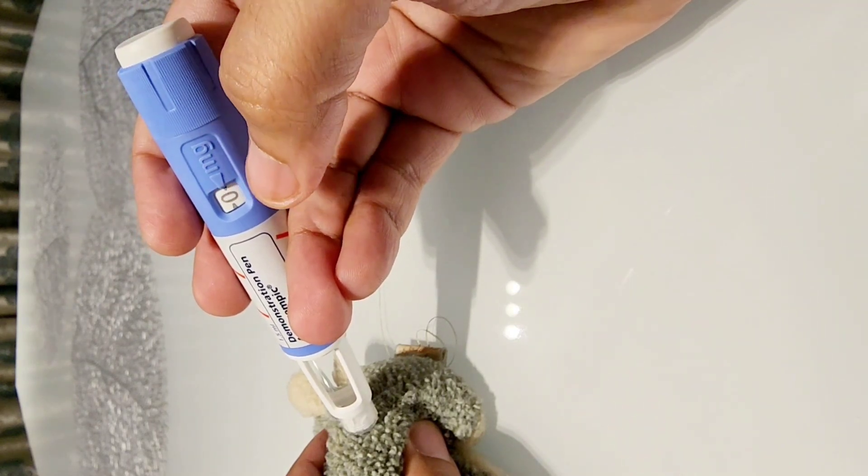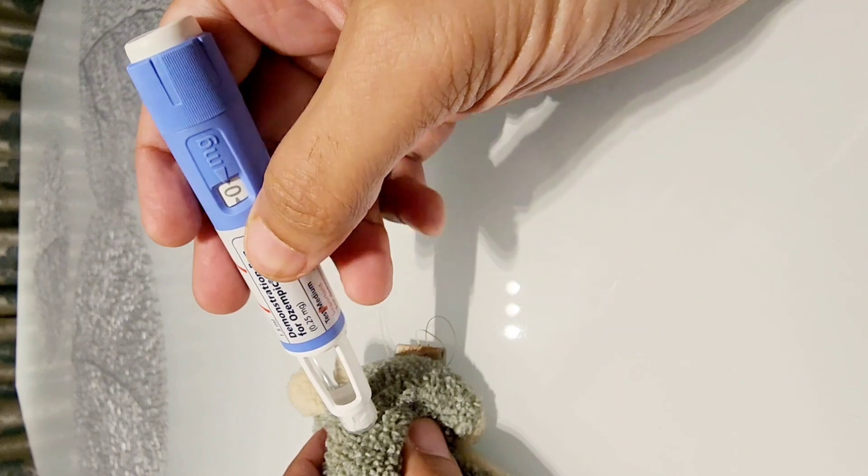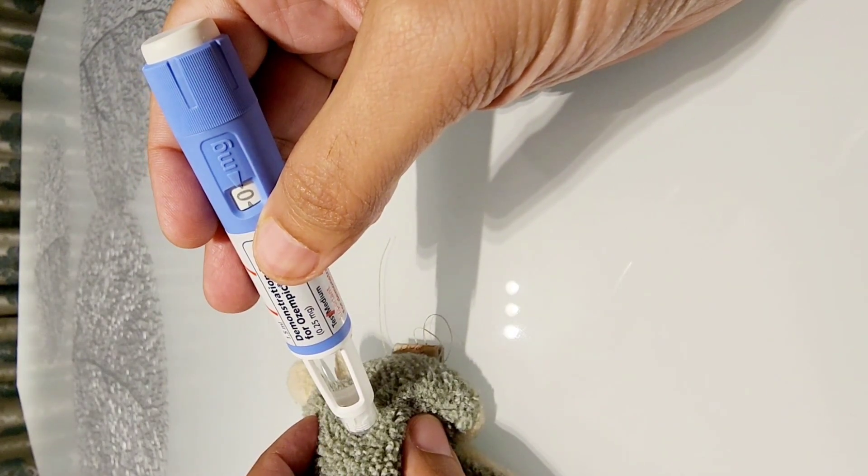And when you are injecting at the back you have to see that the whole dial goes back to zero. When it has gone back to zero the medication has already been administered. Now you have to count till 10.